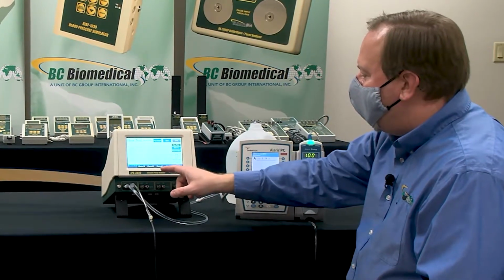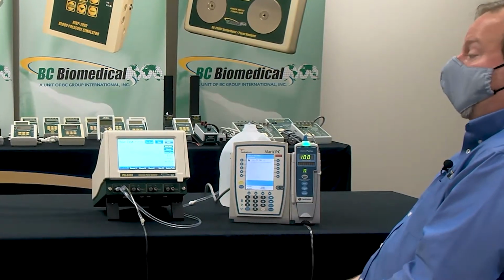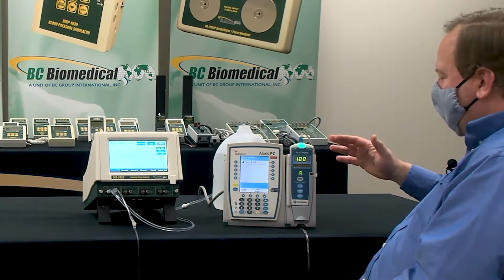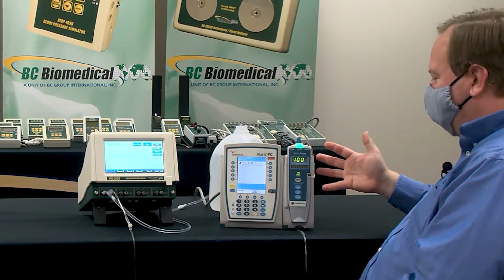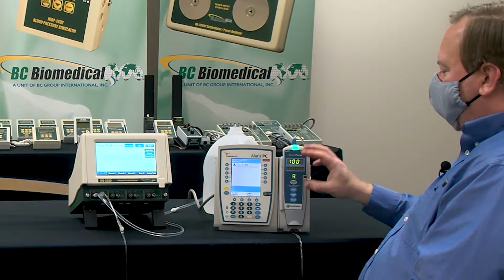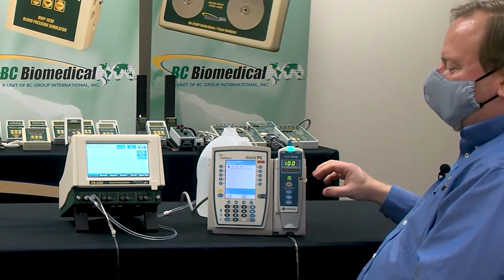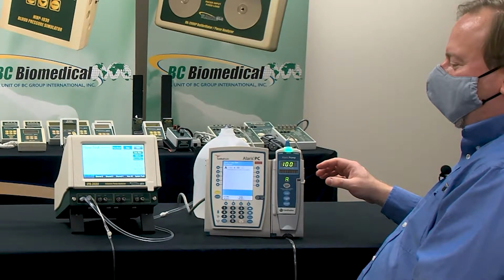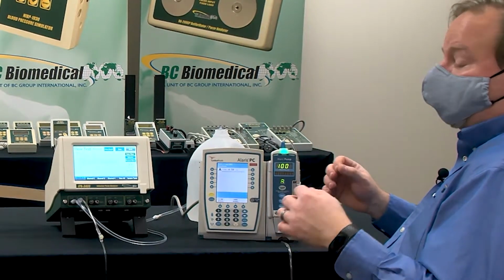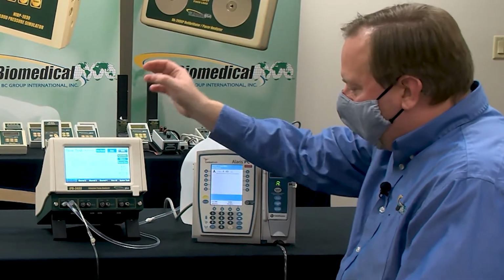And so if we go to our graph, we can show average flow. Here's our instantaneous, that's what's happening. The flow rate is all over the place because these fingers are moving and then they pause, and then they move, and then they pause. And every once in a while it'll recalibrate and adjust itself and say, oh, I need to pause a little bit, and now I'm going to go again. And so you get a pulsatile flow rate, and that's what we see here in the instantaneous flow.